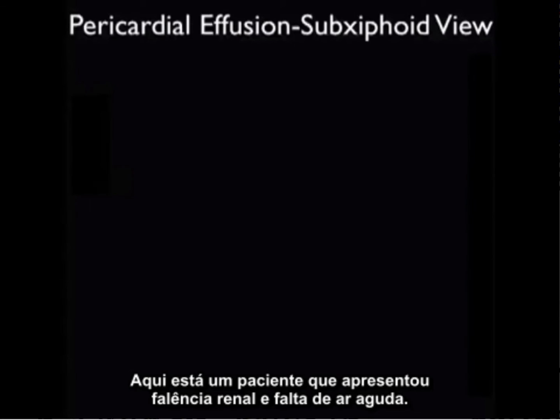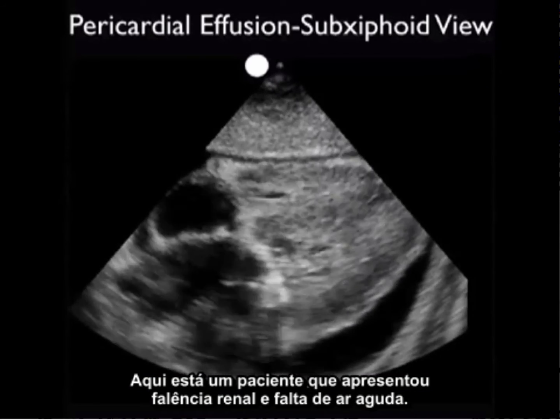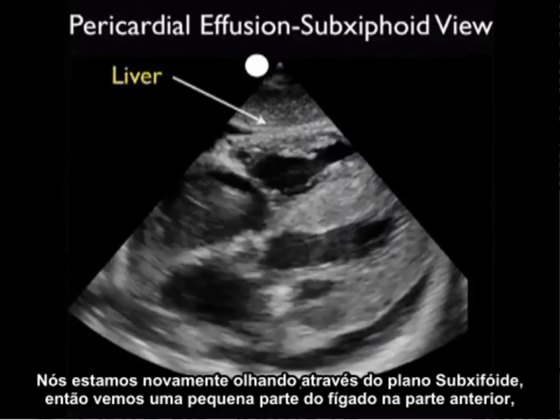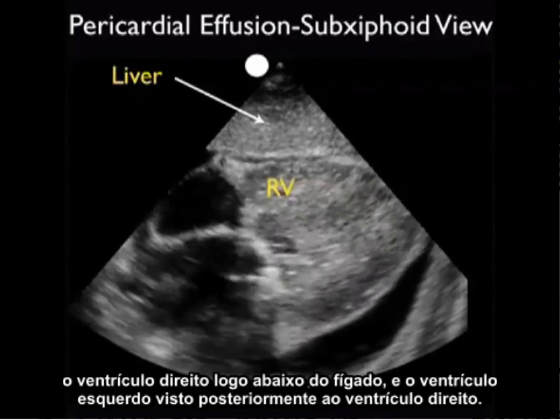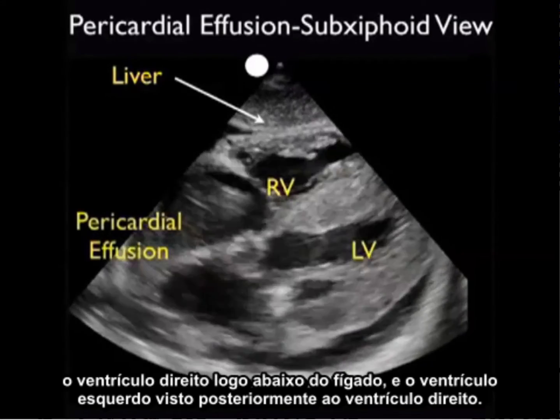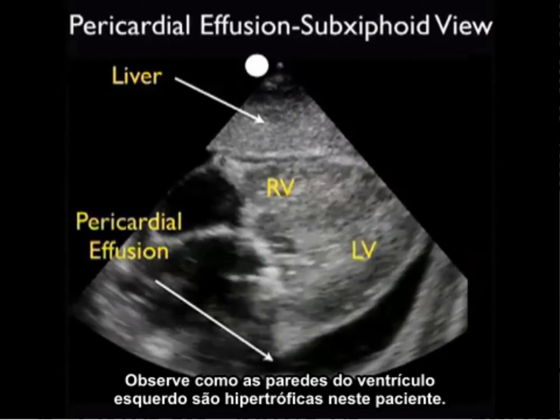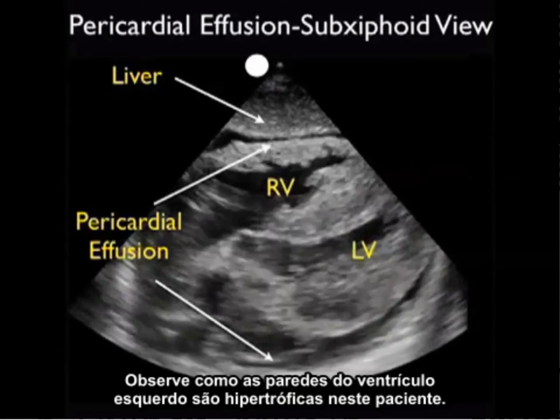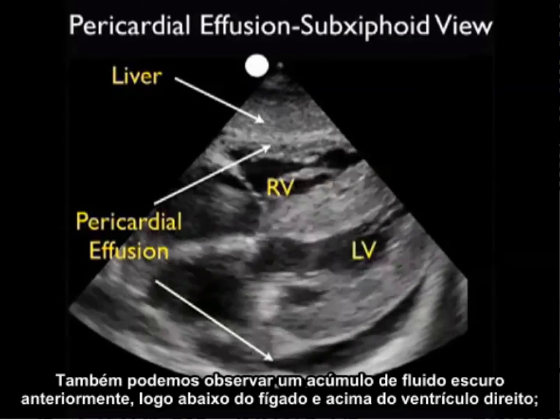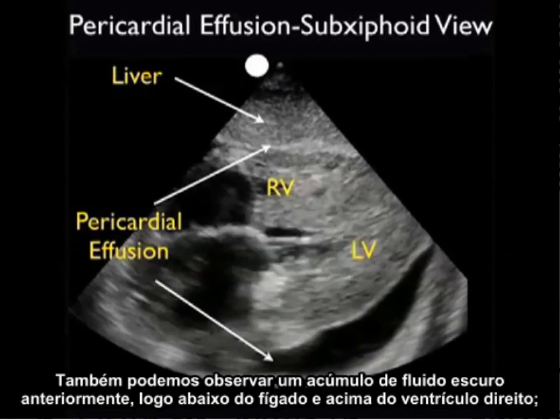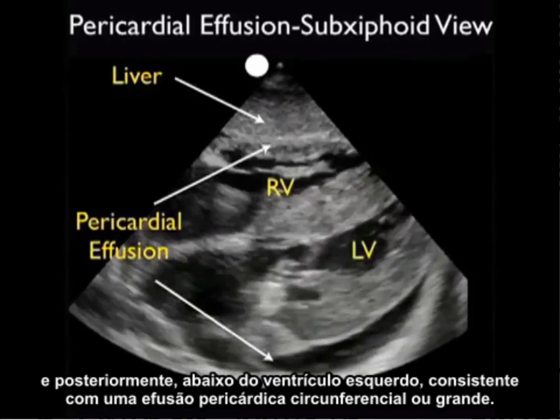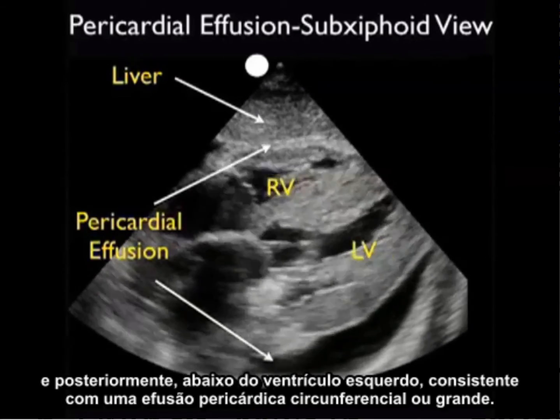Here's a patient who presented with renal failure and acute shortness of breath. We're again looking from the subxiphoid plane, so we see a little strip of the liver anteriorly, the right ventricle just below the liver, and the left ventricle seen posteriorly to the right ventricle. Notice how hypertrophic the walls of the left ventricle are in this patient. We also appreciate a dark fluid collection both anteriorly just below the liver and above the right ventricle, and posteriorly below the left ventricle, consistent with a circumferential or large pericardial effusion.